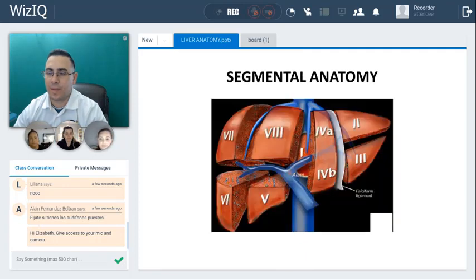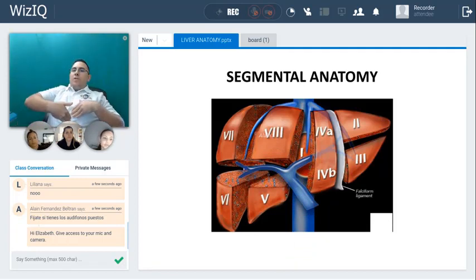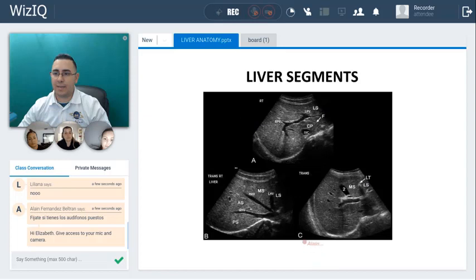When you place your transducer right here just below the sternum, just point to the right shoulder of the patient — and it has to be in transverse plane — then you're going to have a picture like this one here. We have a good transverse view: you're in transverse, you point to the right shoulder of the patient, and you're going to have this picture.